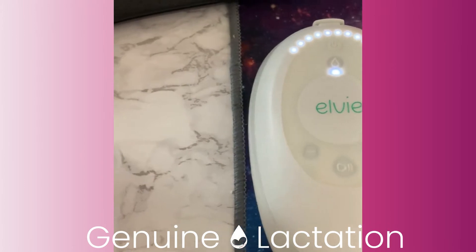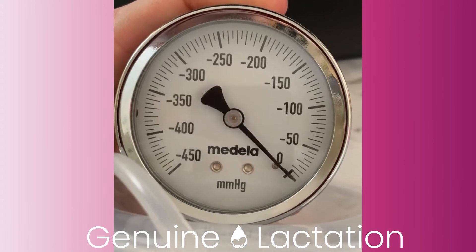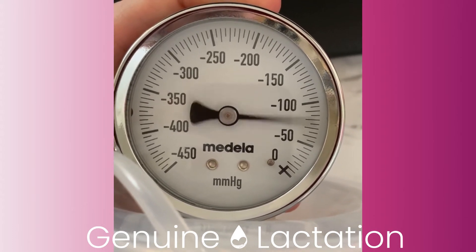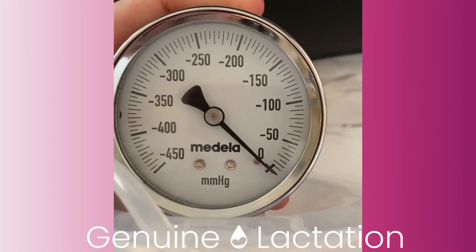This is the LV Stride on its max setting with a Spectre cup. Of concern is that this pump is going up to about 325-330, and the pump is really only supposed to go to about 250. So this is proof that you can change the suction with different accessories.